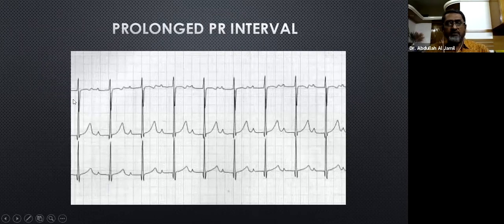This prolonged PR interval, as shown here, is of quite long duration, near about two large squares.